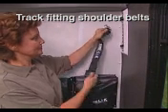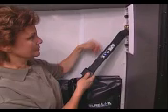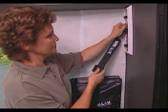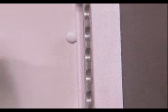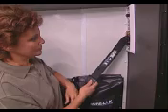There are several types of shoulder belts that may be used. Non-retractable shoulder belts easily attach to a section of track mounted on the vehicle side wall, which provides increased positioning flexibility for multiple station vehicles. Insert the track fitting into a slot that gives the correct placement of the shoulder belt on the occupant. A non-retractable shoulder belt is recommended for passengers with limited upper body control.